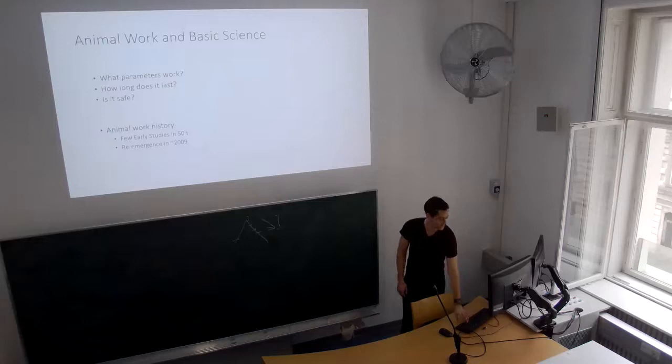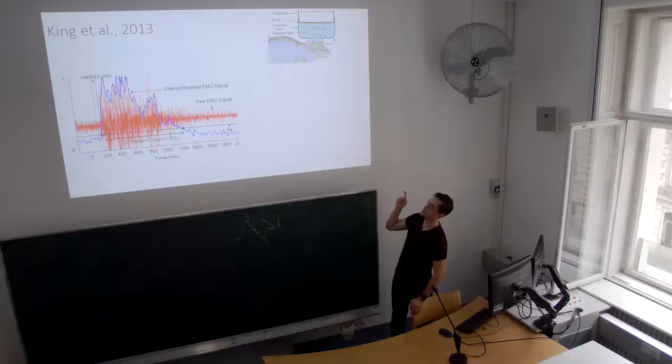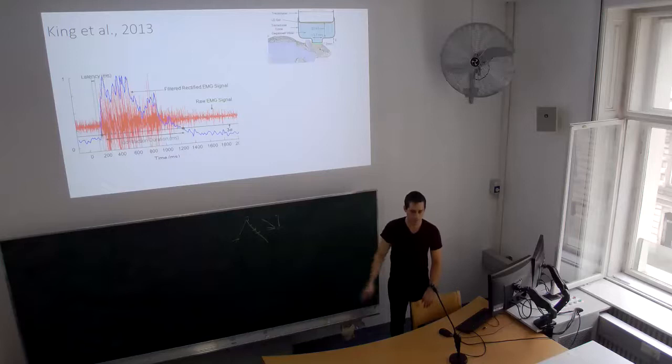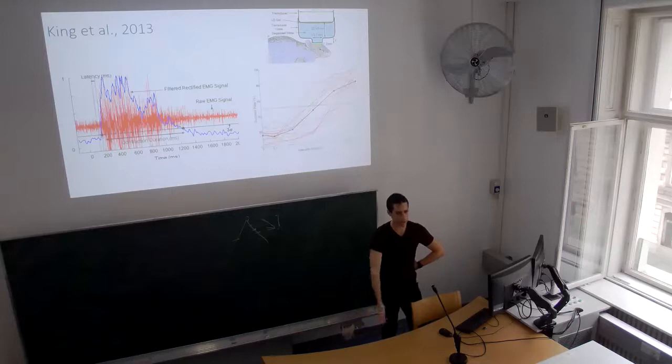For instance, this is a great 2013 paper, and it really demonstrates the potential efficacy of ultrasound. They're applying this to the rat motor cortex, and you get a contralateral flick. So you get a tail flick or a hind limb flick, and you can see it on the EMG. They use this to test a whole bunch of parameters. There's this obvious observation of neuromodulation, and then they could vary all these parameters and see the success rate of generating a hind tail kick.